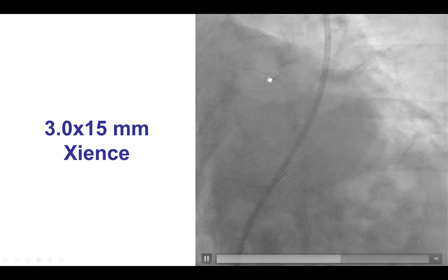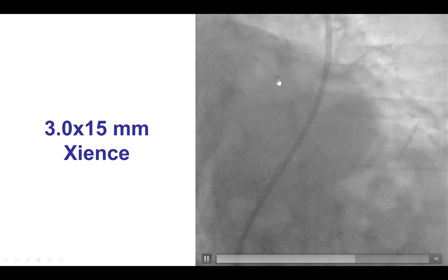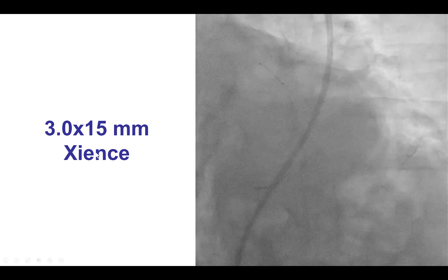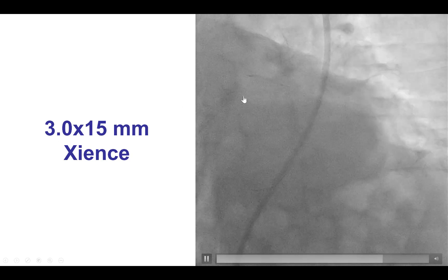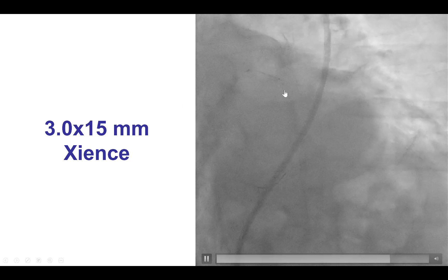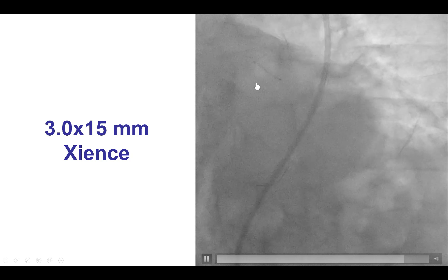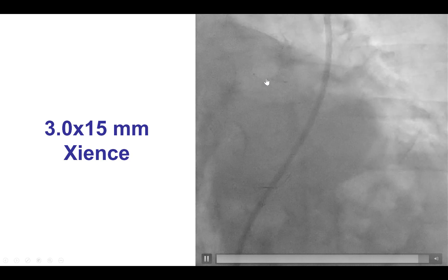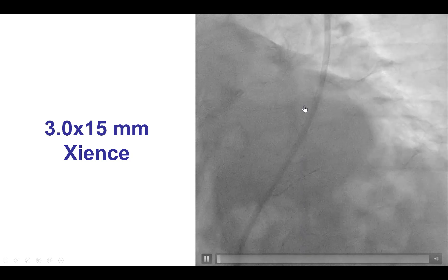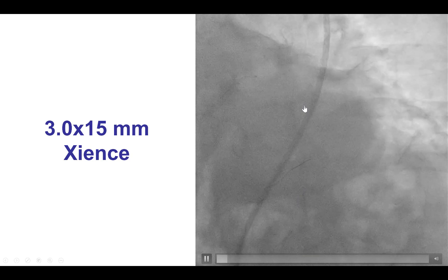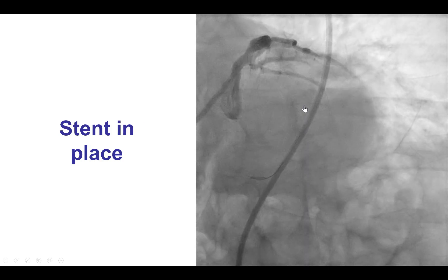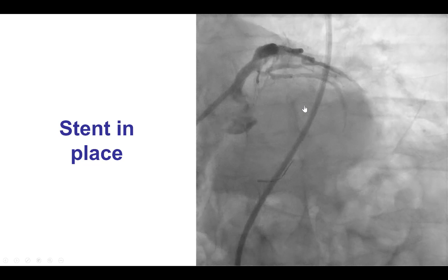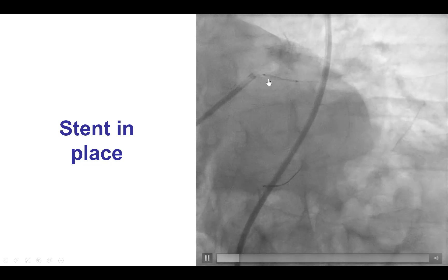One of the options to facilitate delivery is to do predilatation, which we had done, but also to use a shorter stent or a thinner-strut stent that can be more deliverable, or using the buddy wire technique, or potentially using a guide extension. But eventually, by advancing slowly, we were able to get the stent into position.